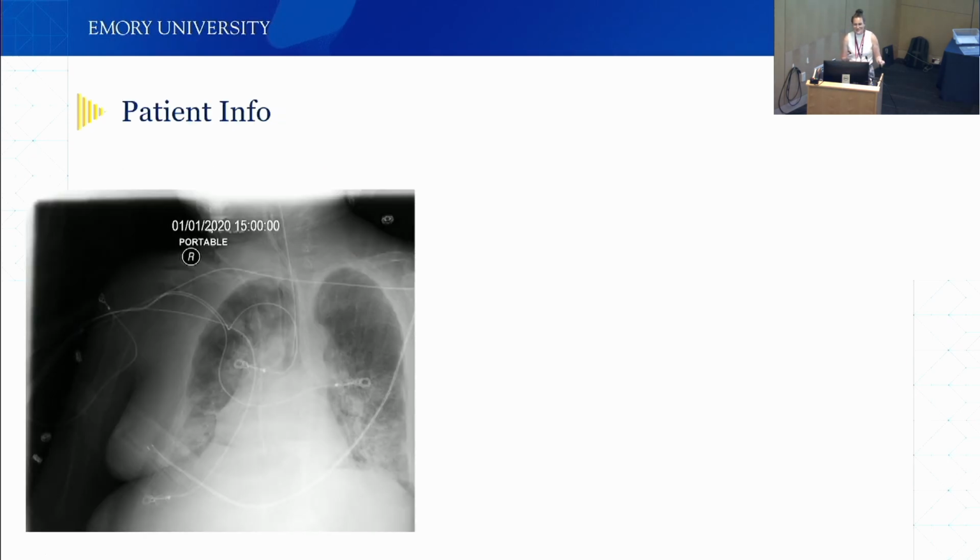And I think we mentioned anonymization. We ran into this issue, that X-rays are from the early 1900s, where you had film and they would stamp the actual time and date into your film, which was great. When I was young, you still had to develop those picture image rolls, and you would have a year on it. Now we have digitized radiographs, so you would say that they would get rid of all of that and put it in the DICOM header, but they don't. Emory, and I'm sure a lot of hospitals, still stamp their X-rays with dates and times.